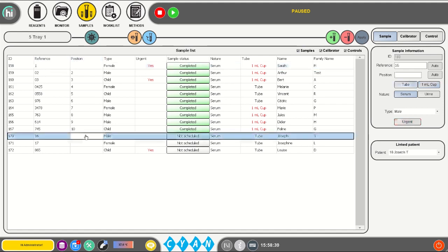You can now select a new sample and insert the position number you just cleared. Press Apply again and continue as such for the remaining samples if you only have a few samples to add to the list. Otherwise, it is more efficient to assign a position to a large number of samples this way.